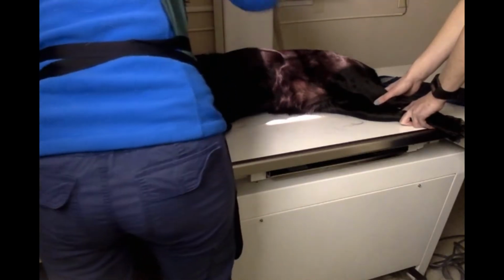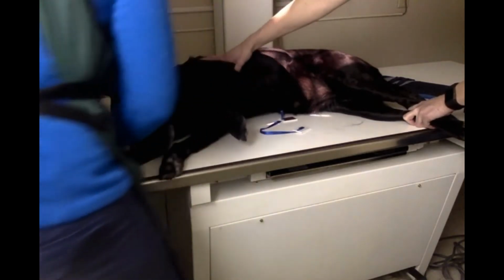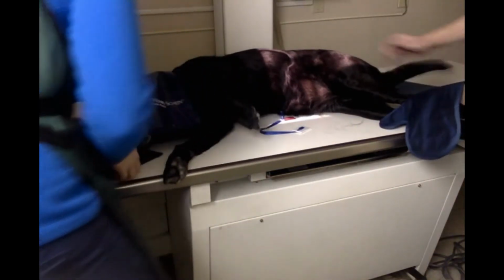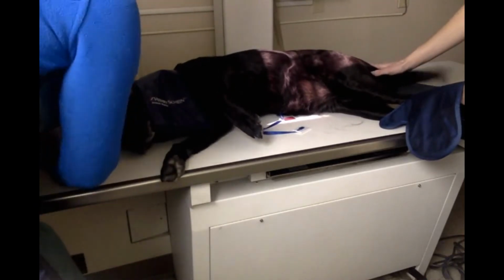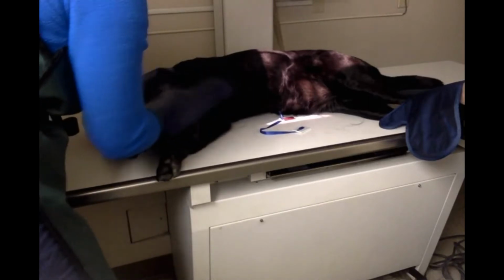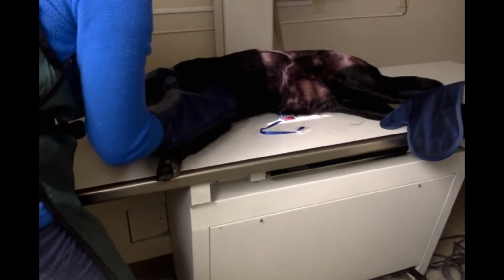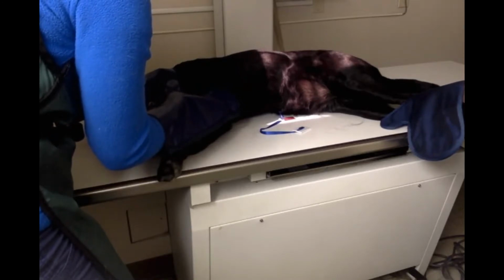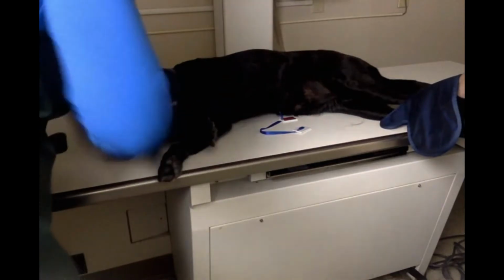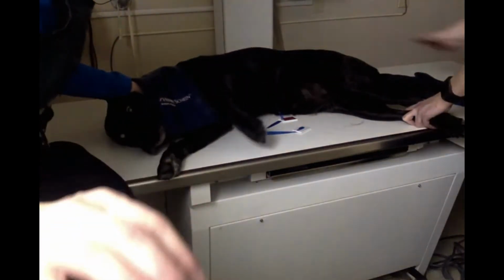I know you're being a good dog. Can you stay? No, stay. I'm going to place my marker. We're already wearing all of our protective equipment except for our gloves here. Stay, Skittles. Okay, I know. So now I'm going to heat up my machine. And once she exhales, I'm going to depress and take that photo. Now we can go look at our x-ray.